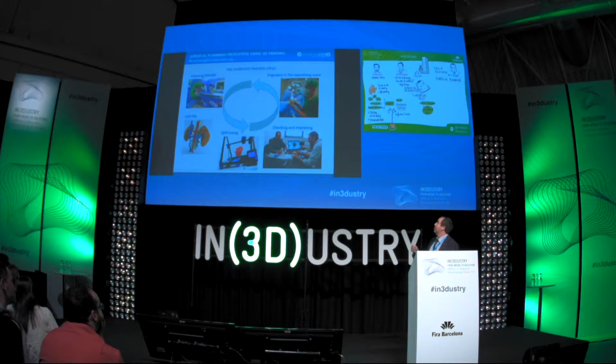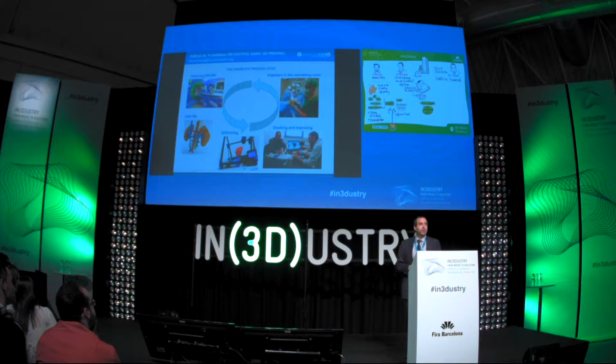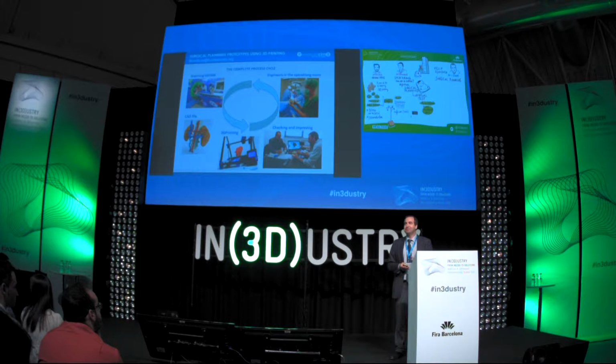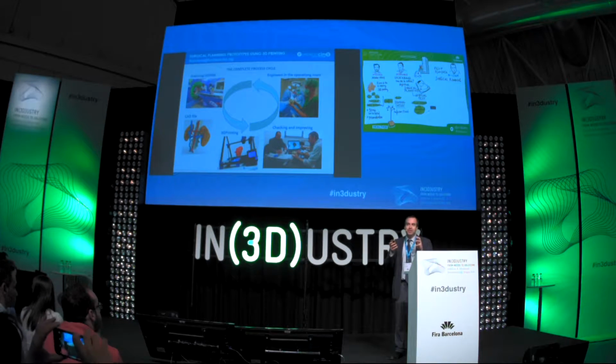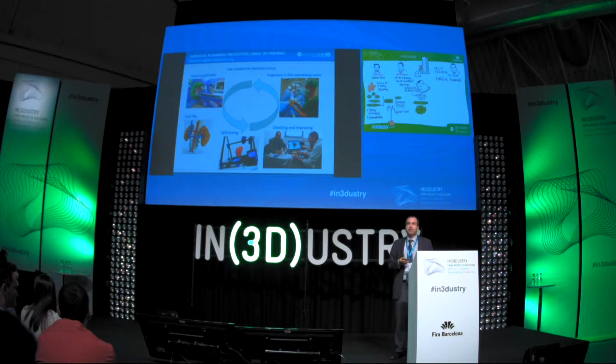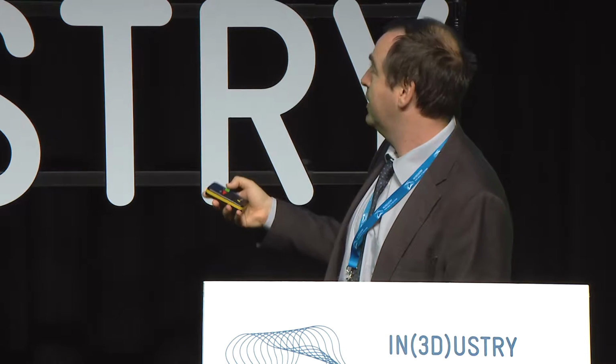And finally, we get into the operation room. We engineers get into the operation room to really take the information on how useful the prototype is. We need to be there in order to see if the next case must be made with another prototype, with another technology, because what you are going to see is that we use more than one technology.